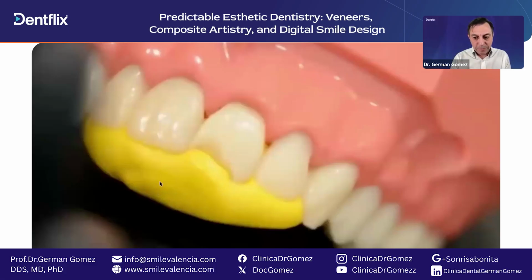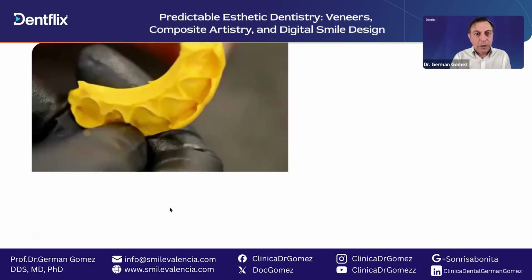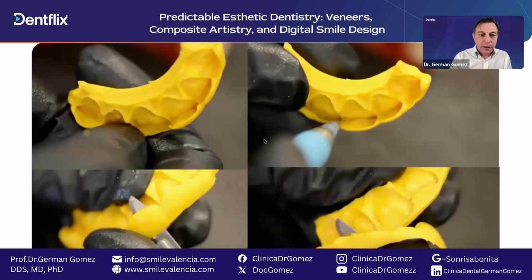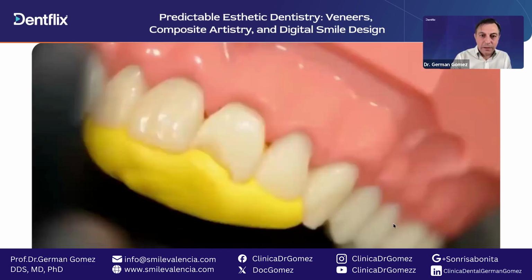We make a putty, and then we make the line where the incisal edge is. Where is the incisal edge? On the neighbor tooth. Then we cut the neighbor tooth and this tooth.